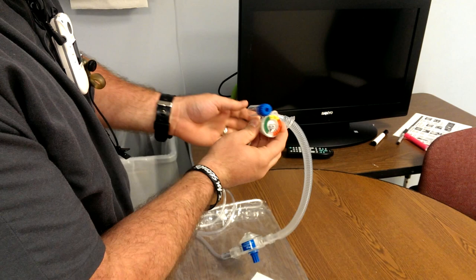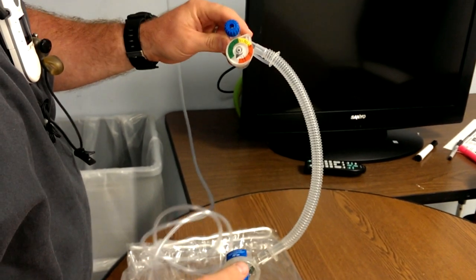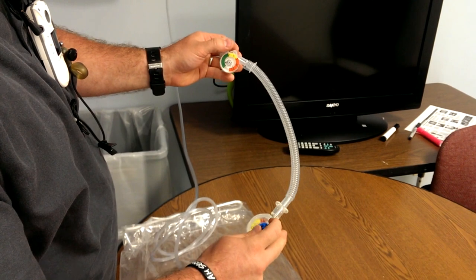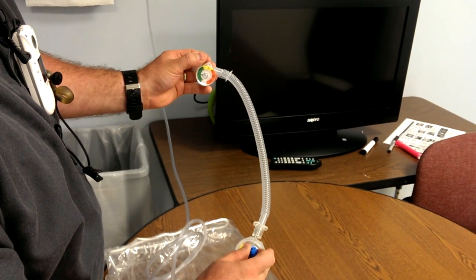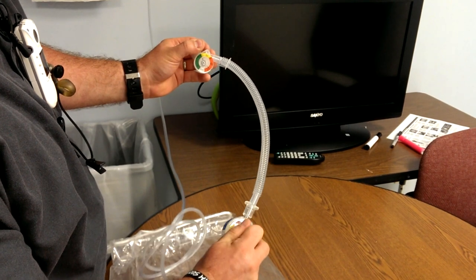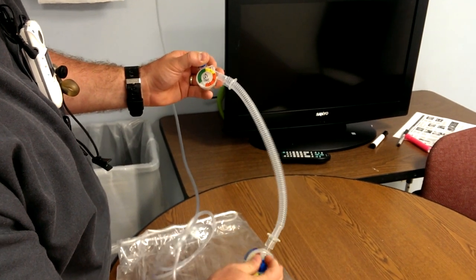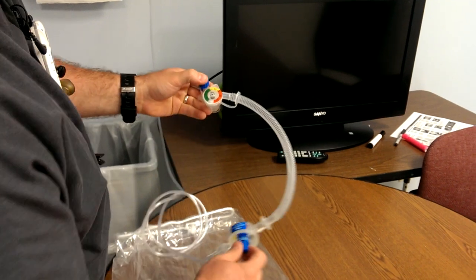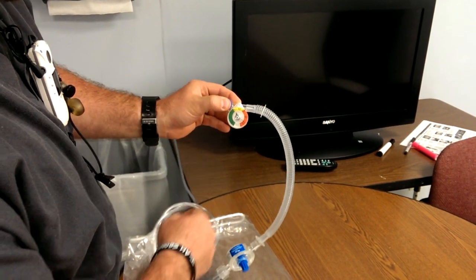I'm occluding this side — this is how you check it. It actually comes with a cover; put the cover over it. Now let's adjust our PIP. I'm going to close this off — it's at about 10 right now. I'm going to slowly increase the knob until our PIP is about 25. It's right about there. If you're maxing out the knob, go over and increase your flow a little bit to give it some leeway. About 25 is what we're looking for. PIP is set.